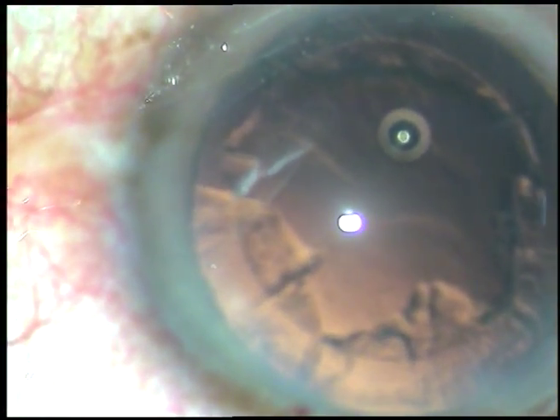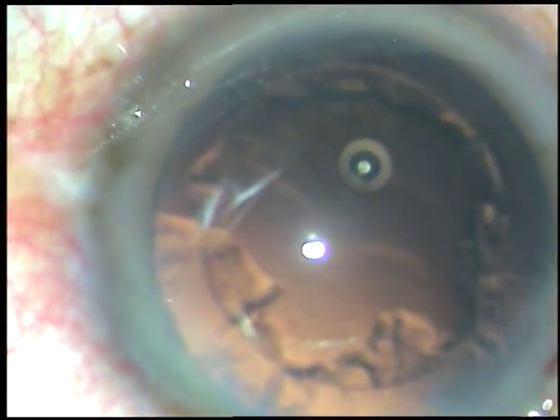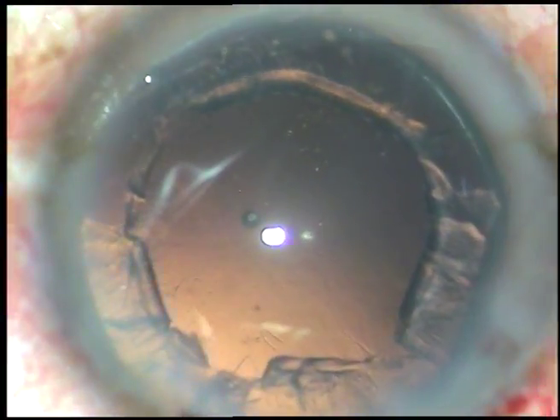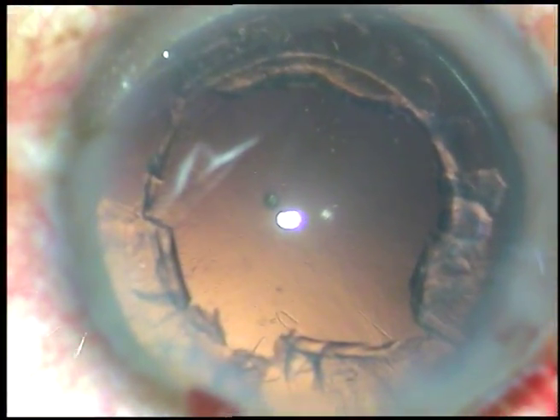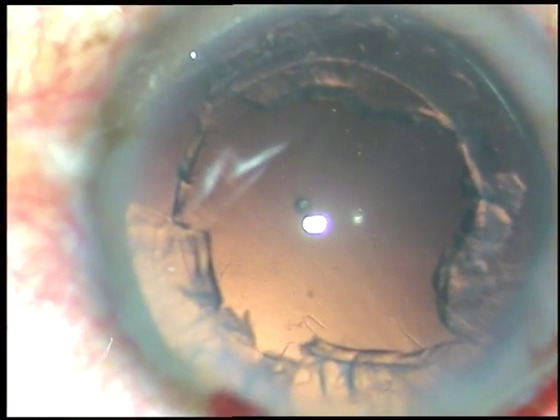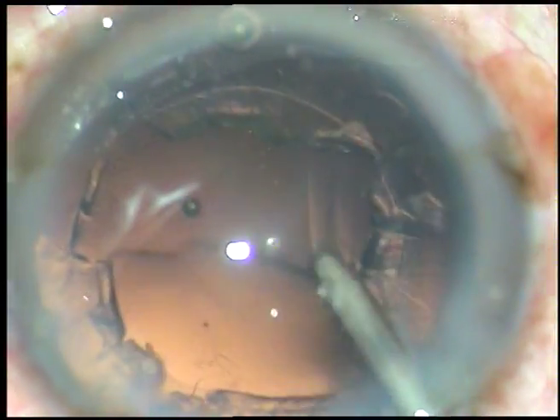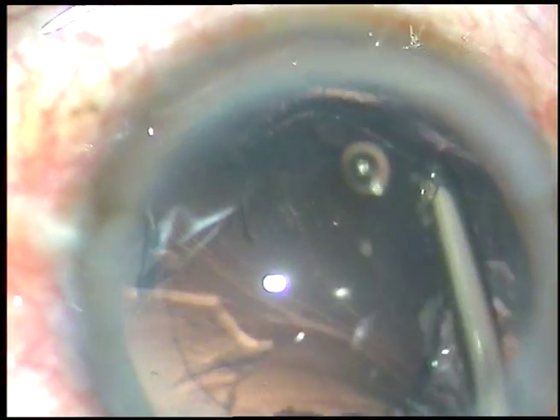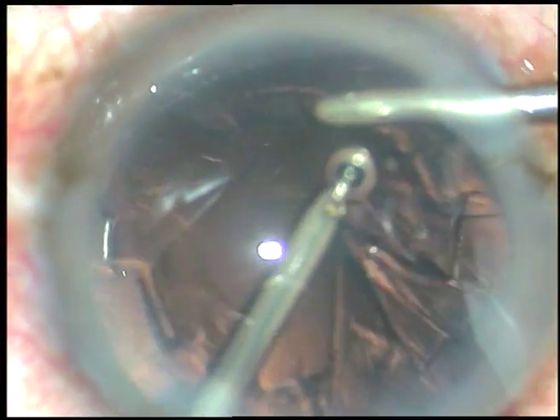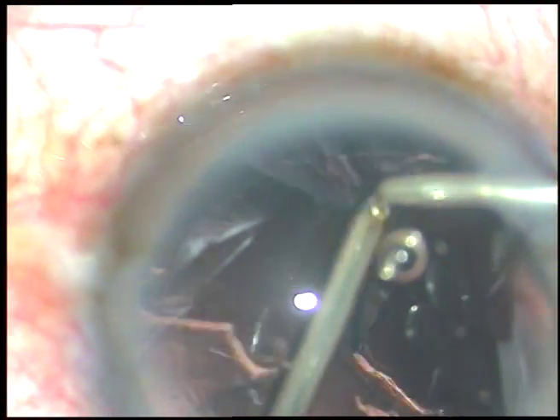Now viscoelastic substance is injected into the anterior chamber and I am waiting for the bimanual irrigation aspiration system to be ready. We have to wait about 15 seconds for it to be ready. Now I am doing a little bit of hydrodissection, and then this is bimanual irrigation aspiration.